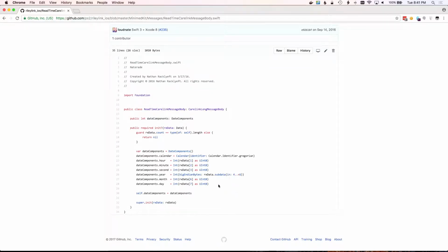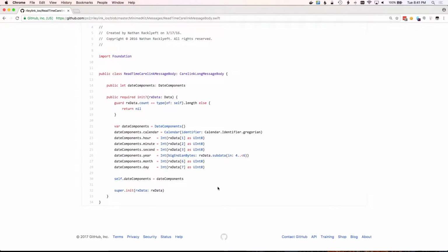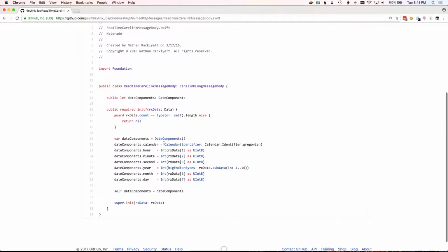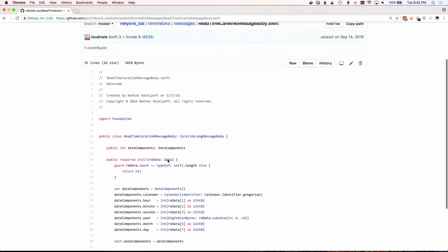Nice. Okay, so if you're looking at this, you can kind of see how there's some like binary unpacking of these bits. You end up with what looks like 4 bytes. Nope, looks like maybe 8 bytes. And they're pulling off little pieces here and there. Some of the bits are used for random other stuff in between all the other bits that are actually date information. I'm not sure exactly why they decided to pack the data in these bits this way, but it's pretty well known at this point, so I'm not too concerned that we won't be able to get there. I am a little bit concerned about this potentially being a different date format than the rest of them. That could get a little interesting.